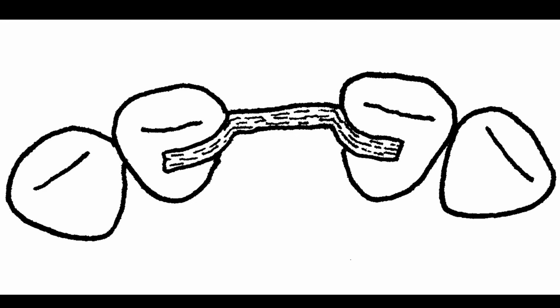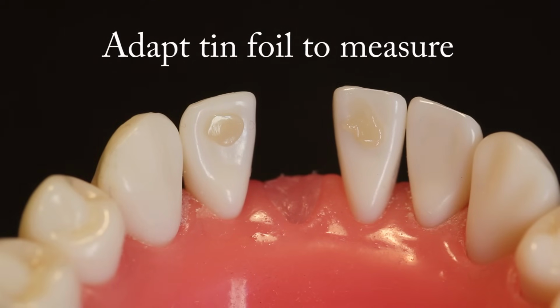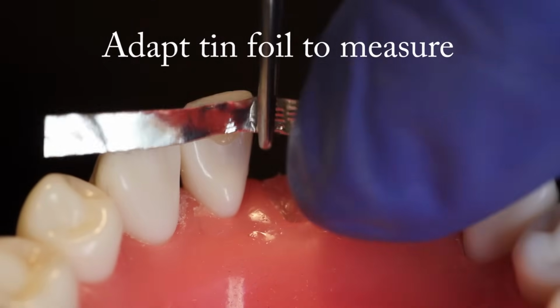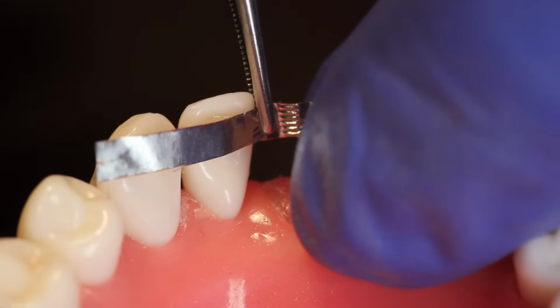Two layers of ribbon will be used for making the bridge framework. The first layer will extend from abutment to abutment. The second layer will double up against the first layer only in the pontic area. Adapt the tinfoil or dental floss to the teeth as you would adapt the ribbon. Cut or mark the end of the template to indicate the length that will be needed to cut the ribbon.